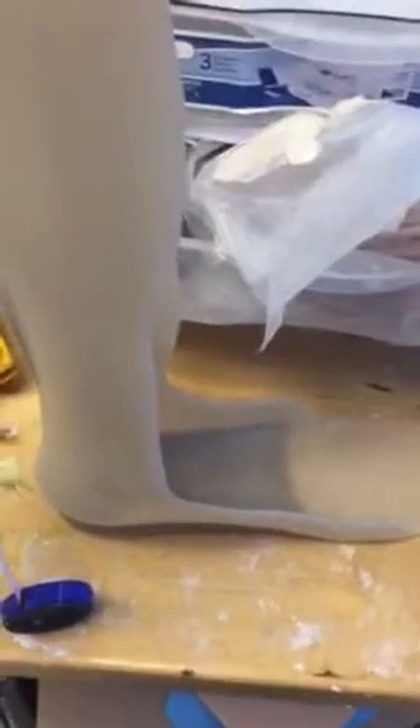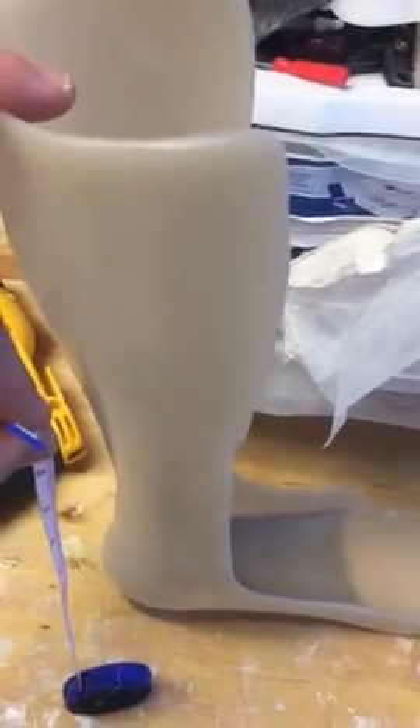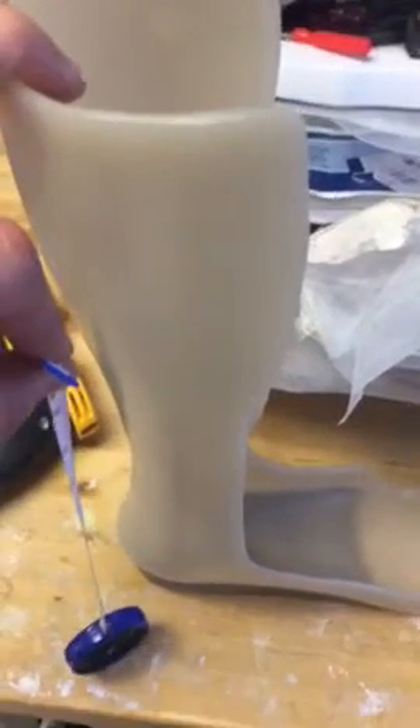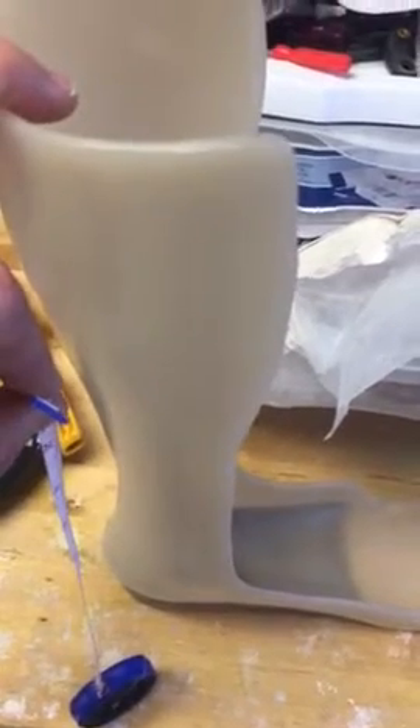You can't use a flimsy plastic when you're trying to help somebody walk — it would be a bad situation if the brace broke down too easily as someone was walking.